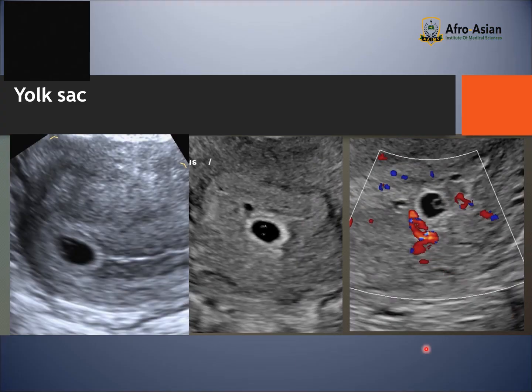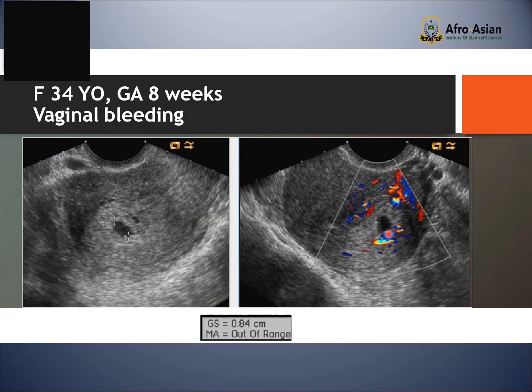Here is our interesting case. We can see by TVS the yolk sac and the gestational sac. There is a small rounded area inside which is not properly visible. This was a case of a 34-year-old female at a gestational age of eight weeks who presented with vaginal bleeding. Here you can see the gestational sac has no yolk sac — so absence of yolk sac.